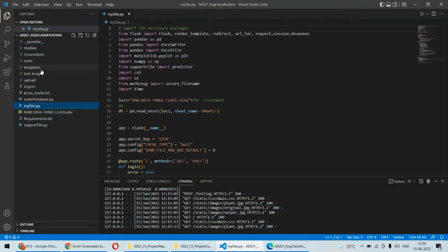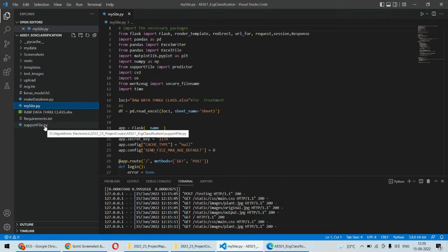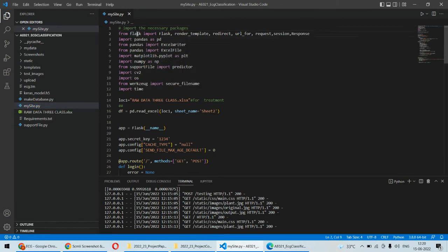This is basically a Python implementation and the deep learning or machine learning algorithms we are using here. In order to create a GUI or the web application we are using the Flask framework of Python.